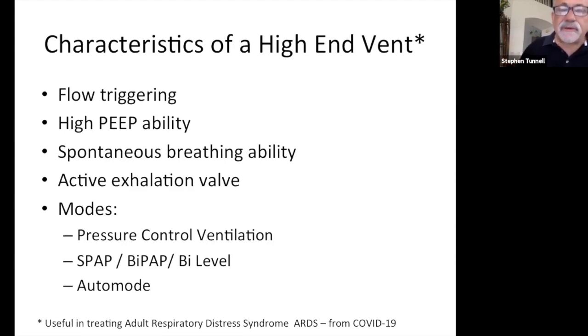Also, when we set our rates on our ventilators too high, we don't give that patient enough time to exhale. So what ends up being the indicator that we have messed up is that we see something called auto-PEEP. Auto-PEEP is unintended PEEP, unintended pressure. So that's a very insightful question.